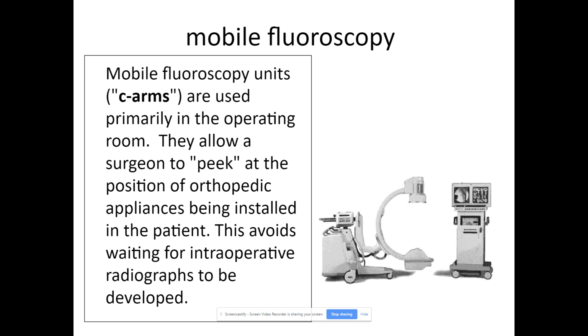But what's nice about the C-arm system is this thing moves all over the place. You'll see it when you go to the OR, because you get a rotation in the OR as well. A lot of times they also use this for pain management, so you might see that in some of the radiology departments. You can switch from an AP position to a lateral, and there are several different locks, so you can go in a lot of different places. But these are used in the OR, in special procedures.